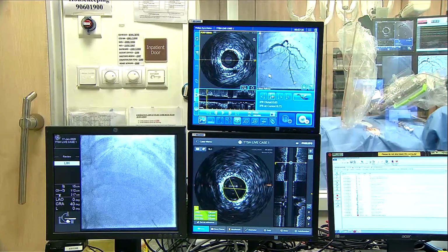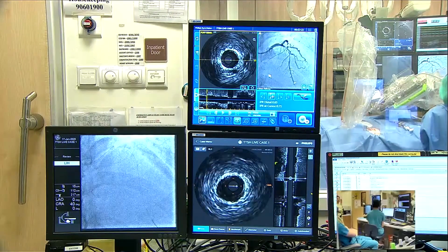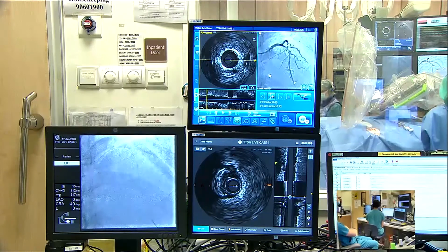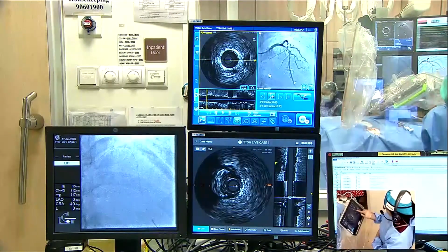So can you come back to a more proximal LAD and see what this is? So this is tight, okay, so we move past that. I think the IVUS got caught then and wasn't doing an awful lot until it came out. Or if there had not been a jump before, theoretically, because it is so precise, you can actually measure the length of the lesion as well. Am I right? I could have, yeah. I might be able to measure this with the wire.